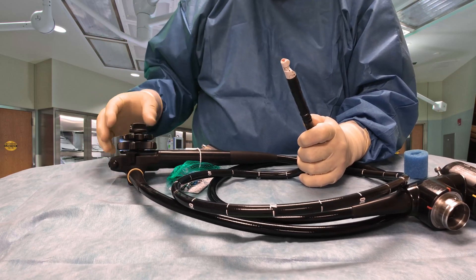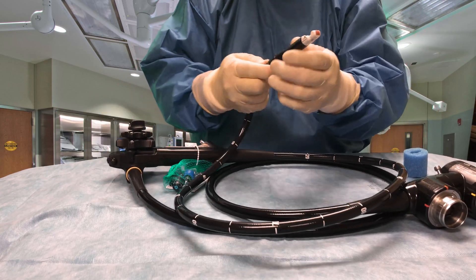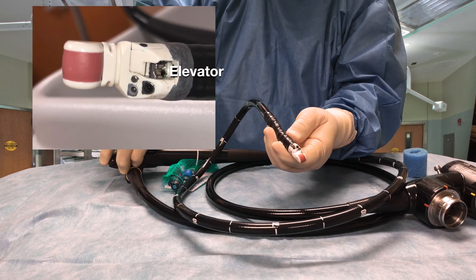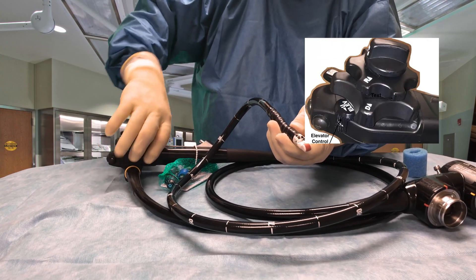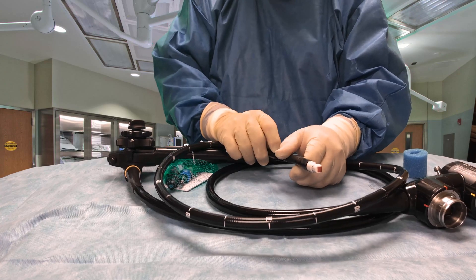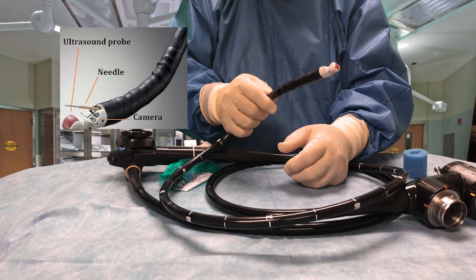This particular scope also has an elevator. The elevator is controlled up here on the control handle as well. That helps to steer the instrument that goes through the scope in the direction that we need in order to usually obtain a biopsy or aspirate something.